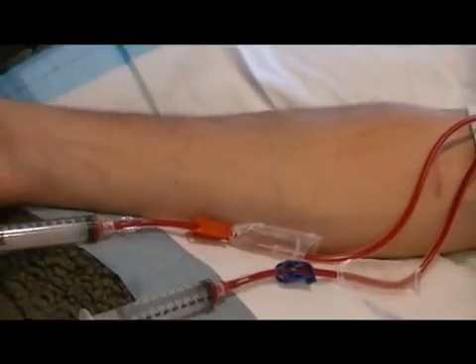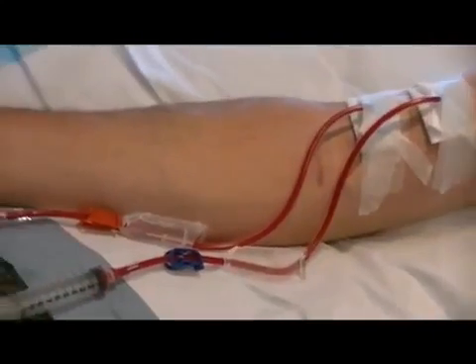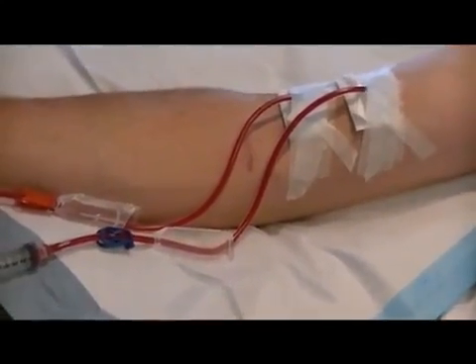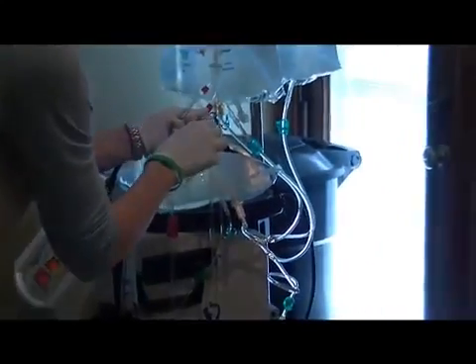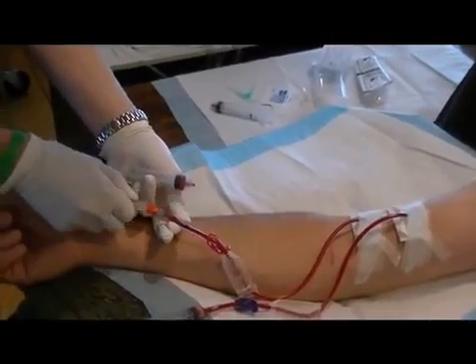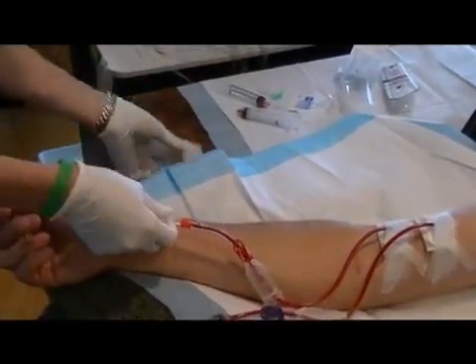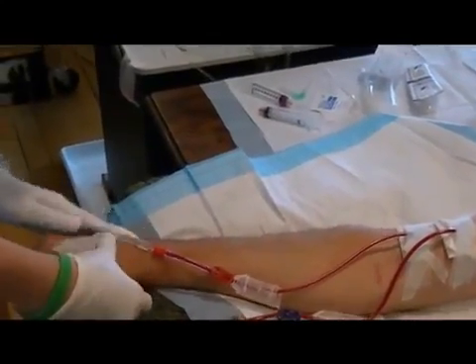Okay, then we'll hook these lines up to the lines on the machine, red to red and blue to blue. And you always put a syringe on here so that it's not just open to the air. You don't want to touch anything. Make sure your caps are tight, and tape this part to his hand so that it's not pulling. It's kind of a long piece of tape for that.